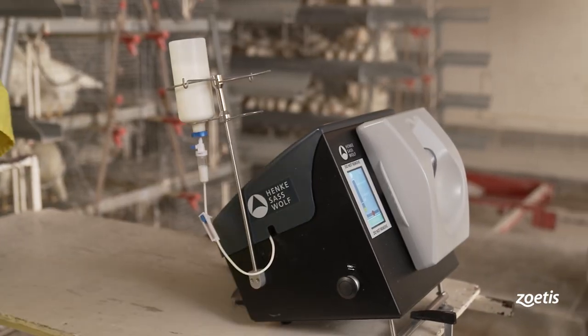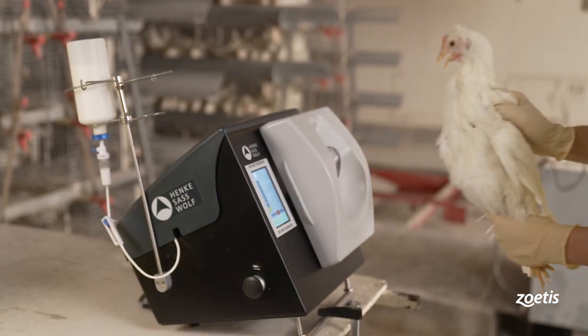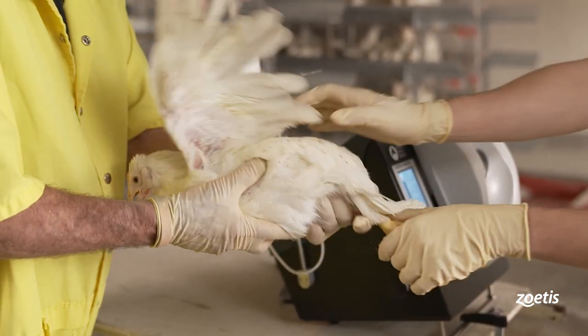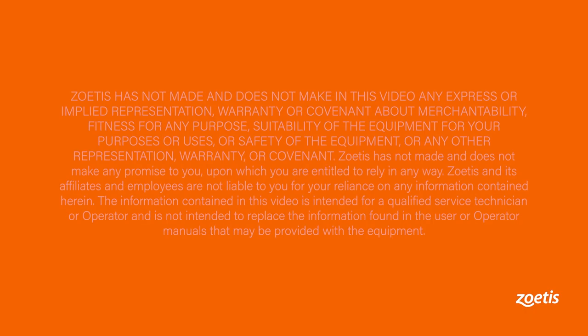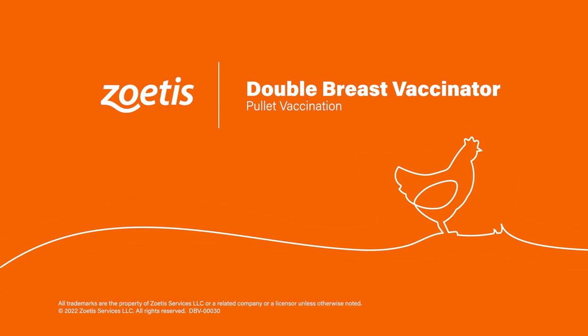By watching this video, you should have a better understanding of how to operate the double breast vaccinator in the field. When used correctly, the device will allow producers to vaccinate birds properly, quickly, and efficiently. Contact your Zoetis service representative for any additional questions regarding the setup, operation, maintenance, or repair of the double breast vaccinator.